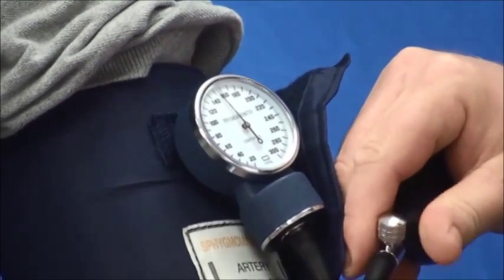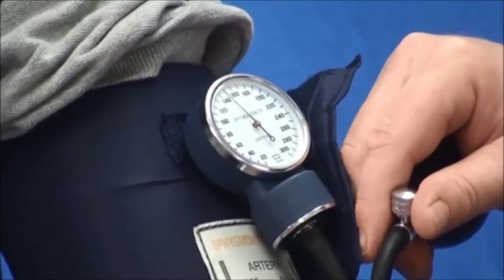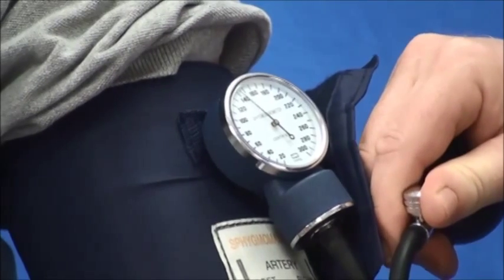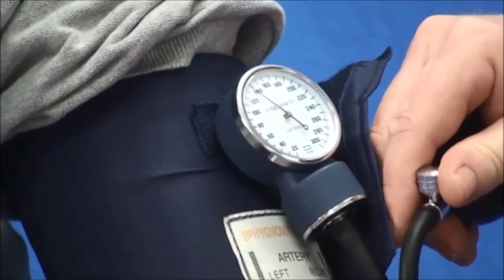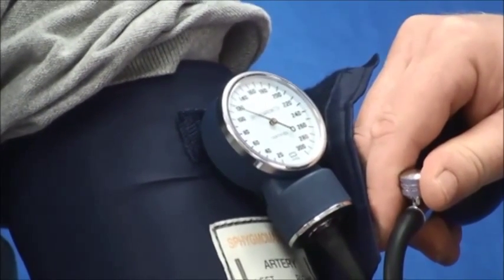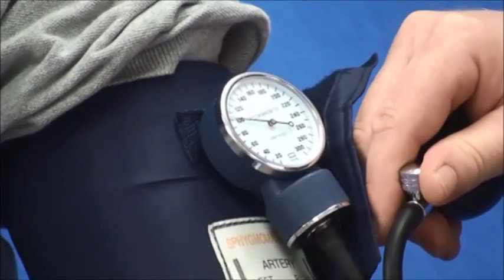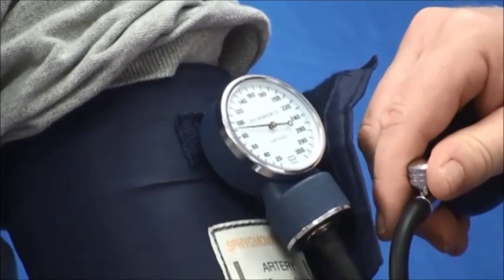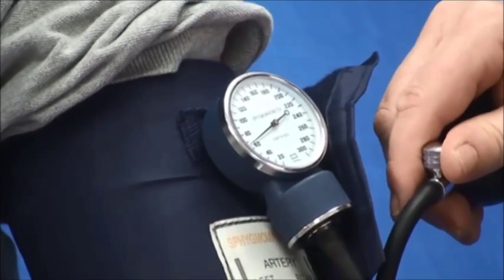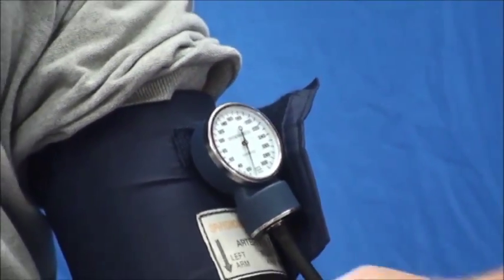Slowly, I'm going to allow the air to come out. At the point where I hear blood or a pulse coming back is my systolic. At the point where it disappears is my diastole. And the procedure is complete.